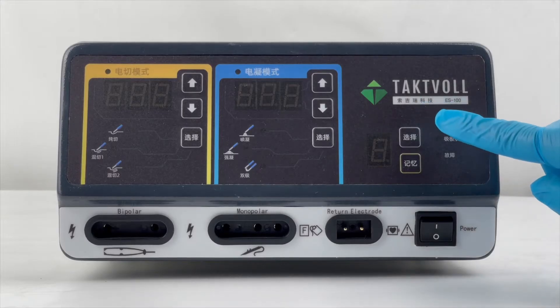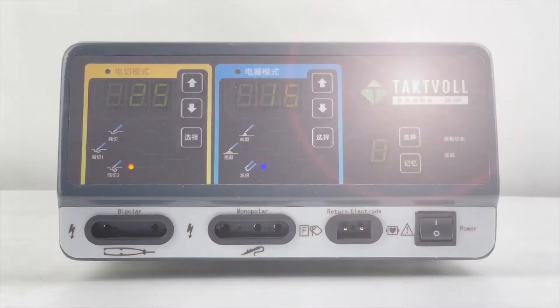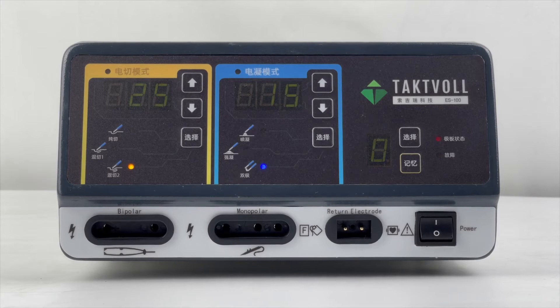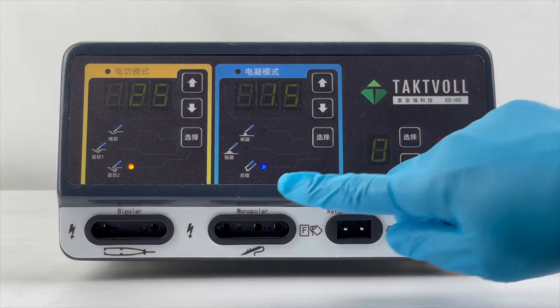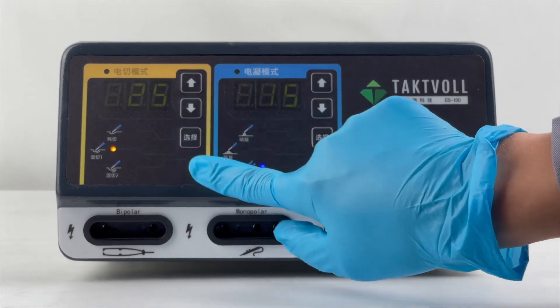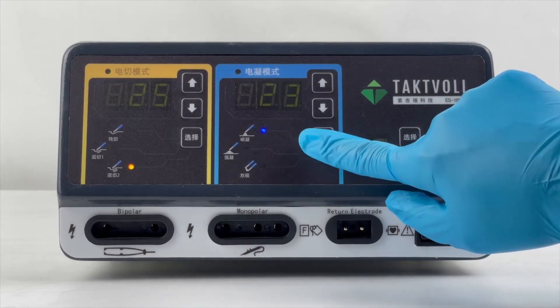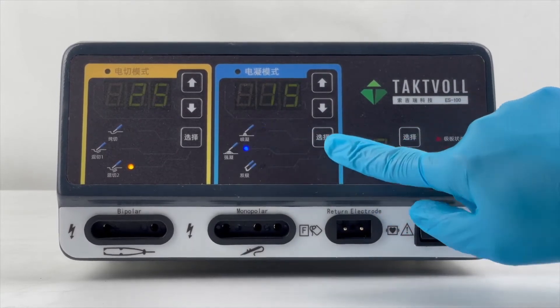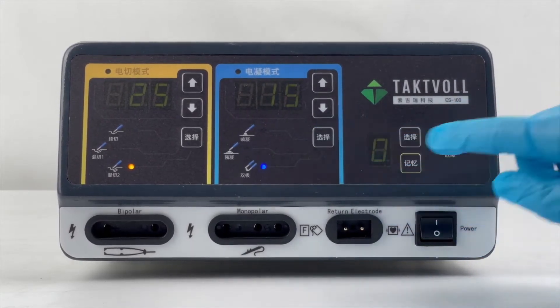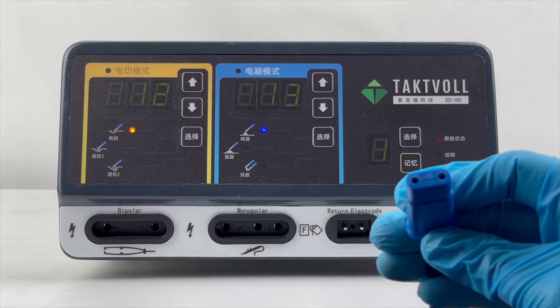We would like to introduce our High Frequency Electrosurgical Generator, S100V. There are 6 functions, including 3 Cutting Modes: Pure Cutting, Blend 1, and Blend 2; and 3 Coagulation Modes: Monopolar Spray Coagulation, Monopolar Force Coagulation, and Bipolar Coagulation. Now let's connect the Neutral Electrode.